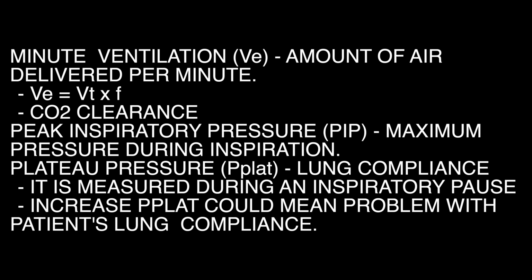Minute ventilation, VE, is the amount of air delivered per minute. VE equals VT times F. CO2 clearance. Peak inspiratory pressure, PIP, is the maximum pressure during inspiration. Plateau pressure, P-plat, reflects lung compliance. It is measured during an inspiratory pause. Increased P-plat could mean a problem with the patient's lung compliance.